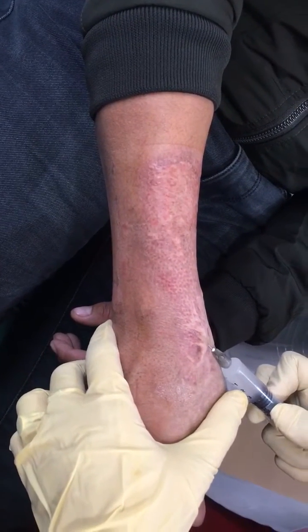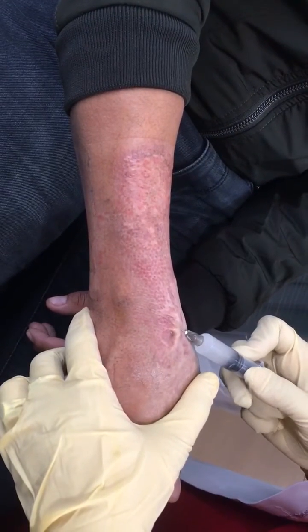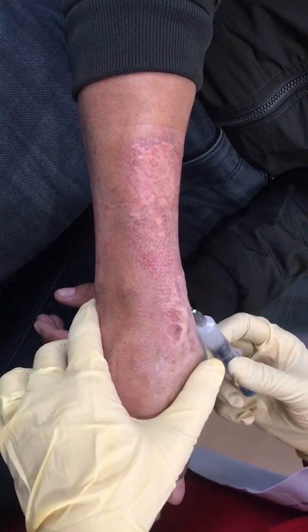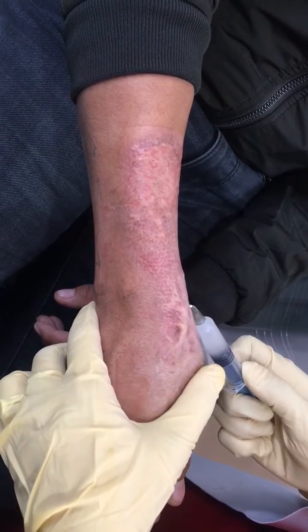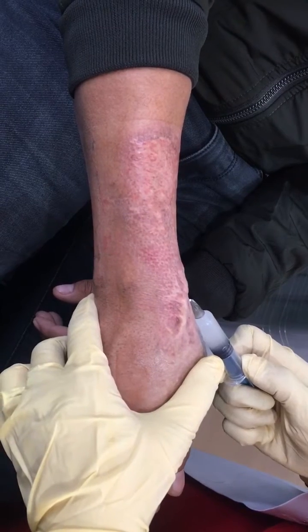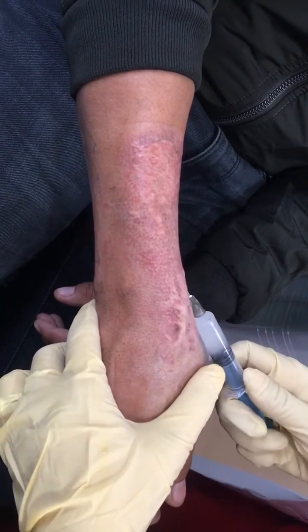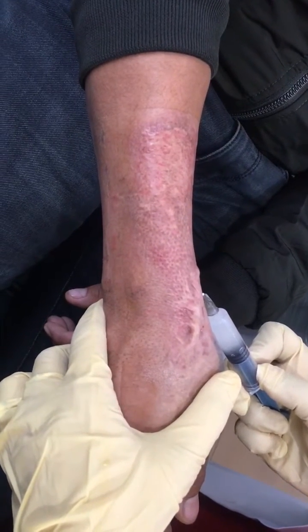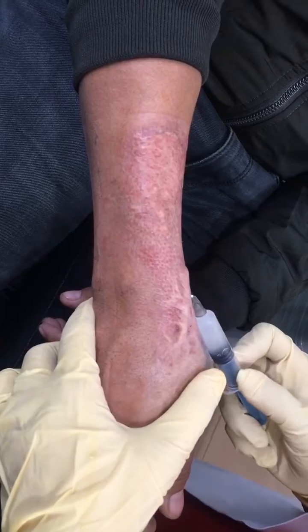We are injecting meso solution into all the scar tissue. Then we will follow it up by CO2 laser. The CO2 laser and mesotherapy will be repeated again after one month.